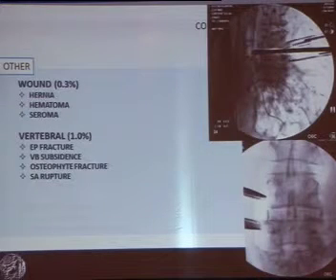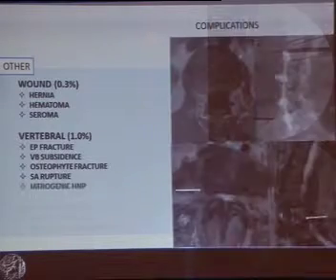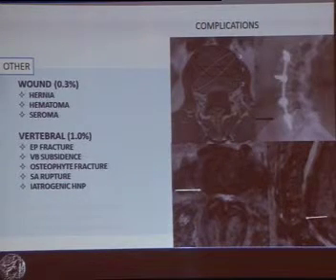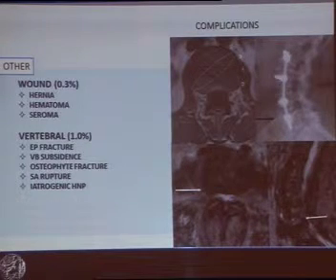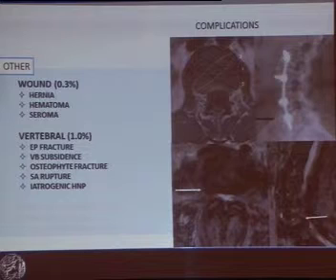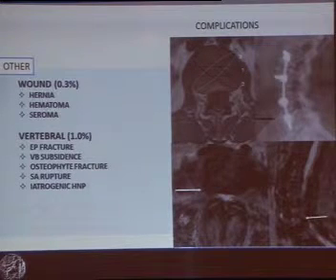rupture of the segmental artery during access of the L4-5 segment, secondary to the cephalad migration of the retractor because of the presence of the iliac crest, and iatrogenic disc herniation when the cage insertion is performed in a wrong anterior to posterior or anterolateral direction secondary to inadequate patient positioning on the operating table.